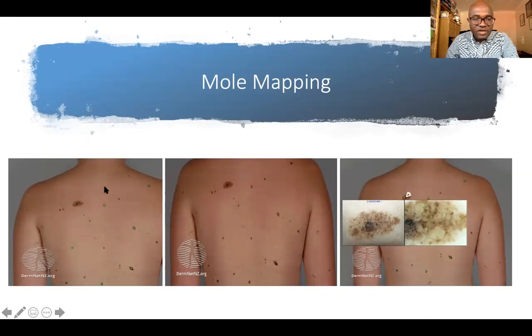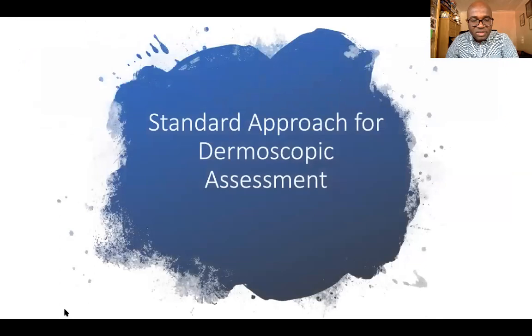Okay, so you have this bigger, wide area on the back. This patient has got multiple moles, and there is one that you're worried about, and you use dermoscopy to map this image. If it's worrying and it's got features, you can cut it out. If it looks benign, you can then monitor. When you come back and you repeat and you see some changes, then it gives you confidence to take it out. Good. Okay, so we're going to take a break.